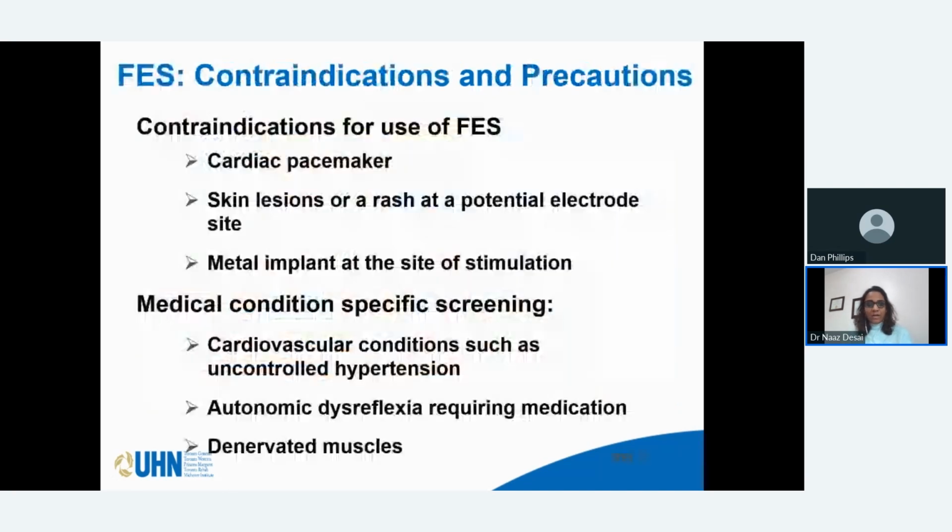Okay, so moving on, contraindications for use of FES. So cardiac pacemaker, skin lesions, or a rash at a potential electrode site, or a metal implant at the site of stimulation. These are all considered contraindications for use of FES. Specific to medical condition, cardiovascular conditions such as uncontrolled hypertension and stroke, these are not necessarily contraindications. These fall more into the category of precautions.